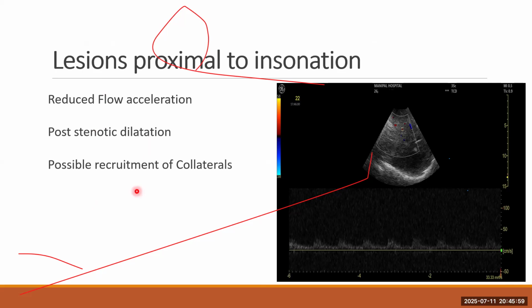Collaterals again is a whole new spectrum of utilizing the advantage of transcranial Doppler to detect collaterals.